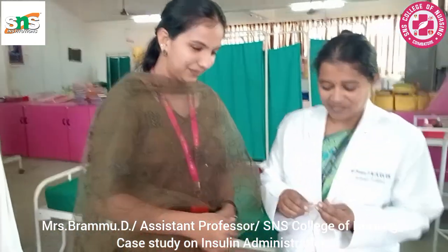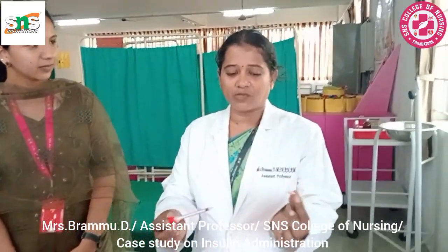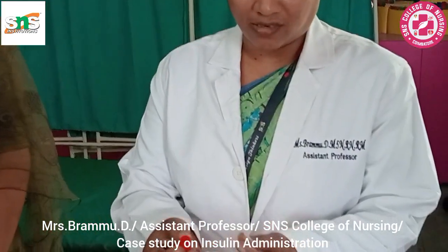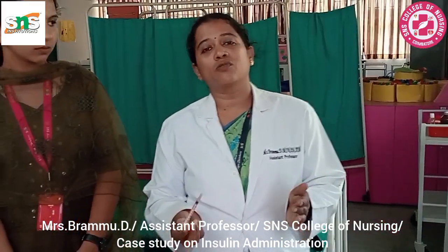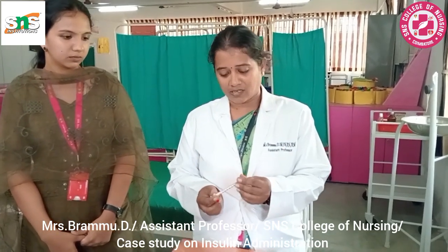Again, I would repeat this point: you have two protective caps. One is on the needle side and the other protective cap on the plunger side. And you nurses, pretty young nurses, there is a chance of needle stick injury. So what we advise is never do the double hand technique. Always try to use the single hand technique.